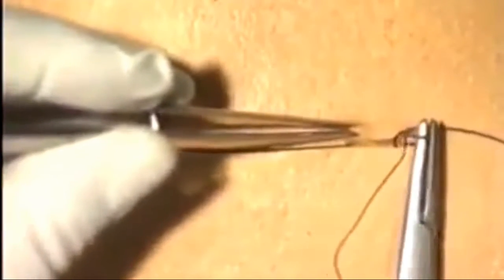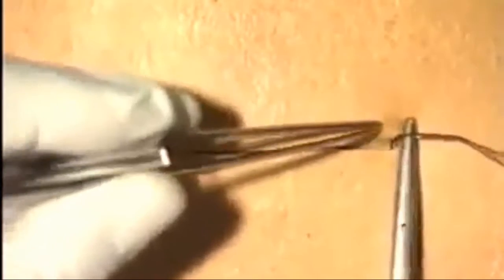Then, on the opposite side of the wound, insert a similar subcuticular bite of the suture material and gently work up the wound, ensuring that each bite does not go too deep into the tissues.